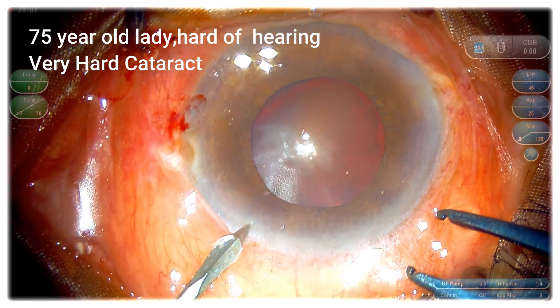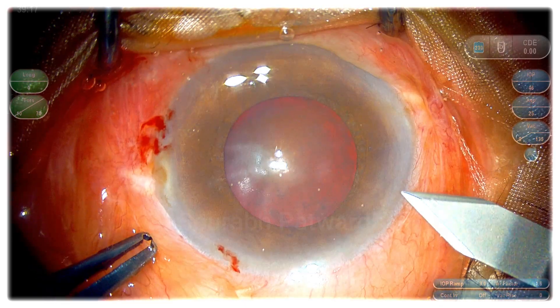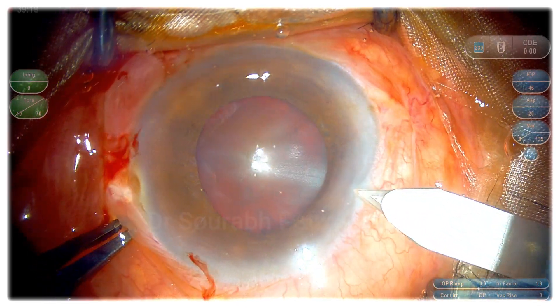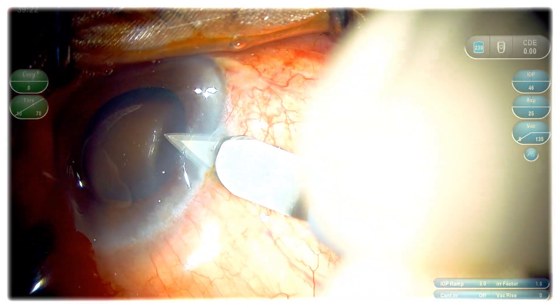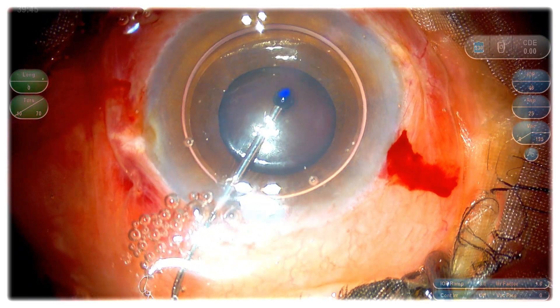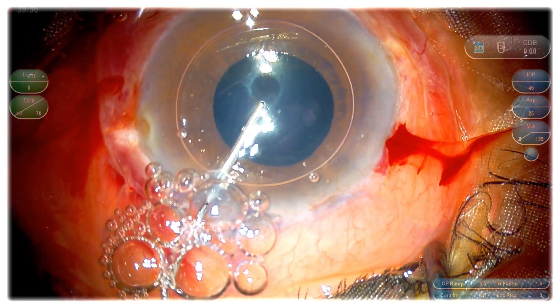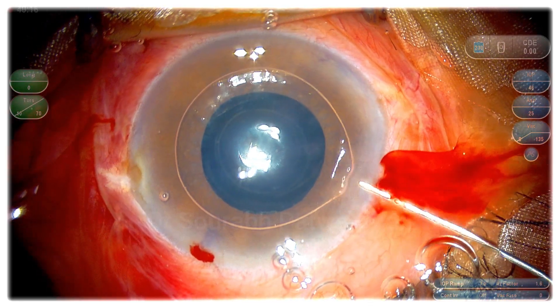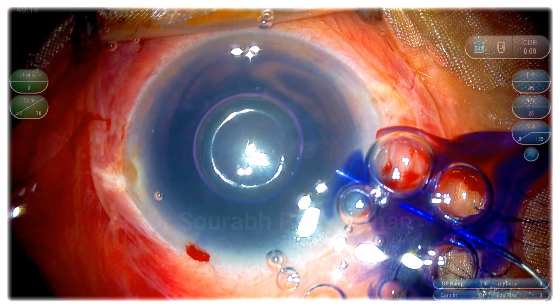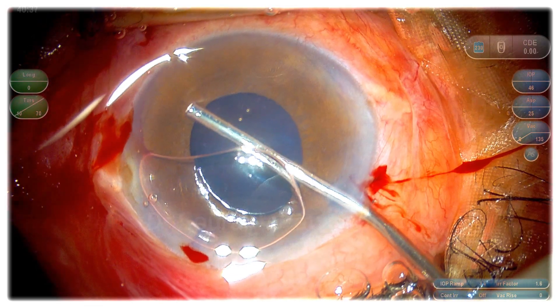In this case, I prefer to give a posterior sub-Tenon block, so that during the surgery I don't have to communicate much with the patient who is already having defective hearing. This is almost like a black cataract. The pupil is not well dilated, so here I am staining the anterior capsule under air. I kept the dye for at least 30 seconds because I know that I need good contrast when I do capsulorhexis.